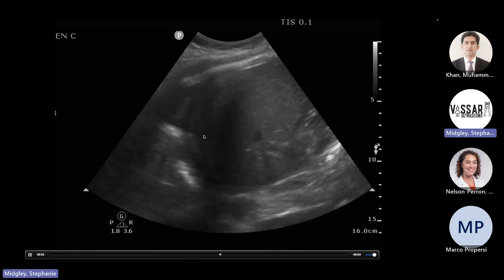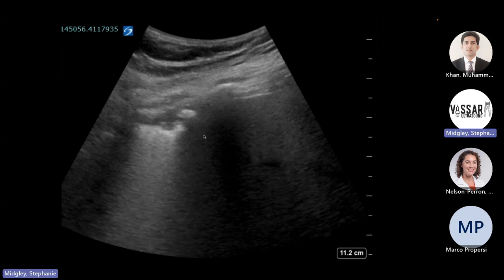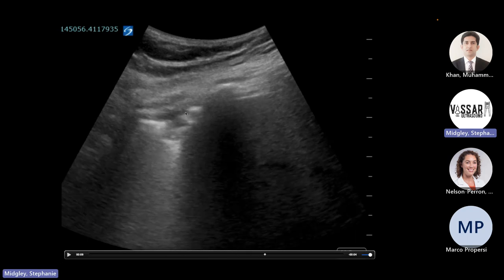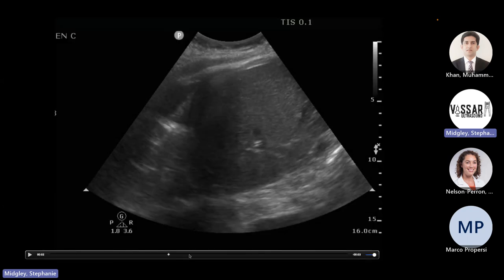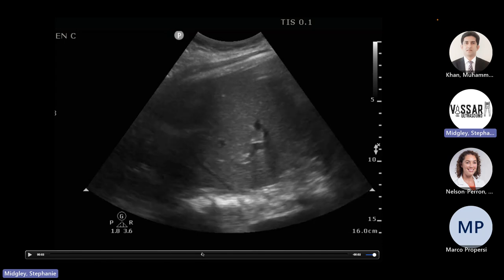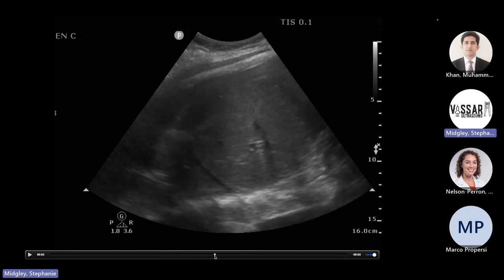This is also pneumonia. When we talk about pneumonia in the lungs, there's sort of a spectrum. So mild kind of looks like this. As you start to get more severe, this little consolidation will start to grow larger and larger and larger. And you'll start to get what's called hepatization, where you get this consolidated lobar pneumonia. And essentially, your lung starts to look like your liver. If you notice right here, how this looks like liver. And this is socked in giant lobar pneumonia.